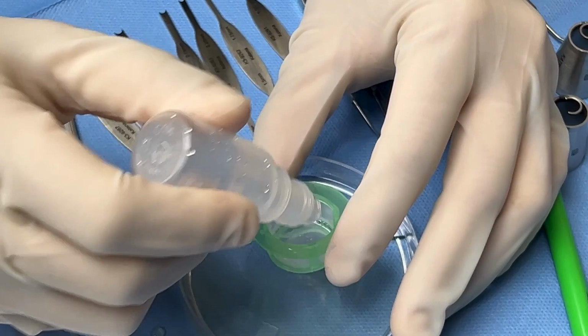My feeling is that rinsing is absolutely critical. Absolutely critical, and I am obsessive about it. This has been a wonderful procedure, but I'm hearing from some people starting out that they're getting some tissue reaction. I haven't seen tissue reaction. I've not seen vascularization. I've seen some edema early post-op, but I'm not seeing inflammation, fibrosis, or scarring.